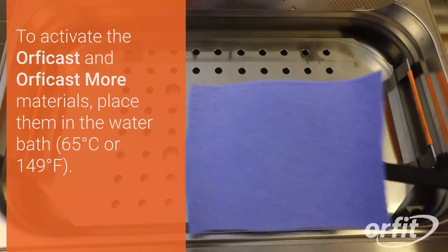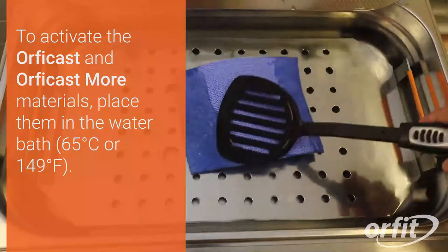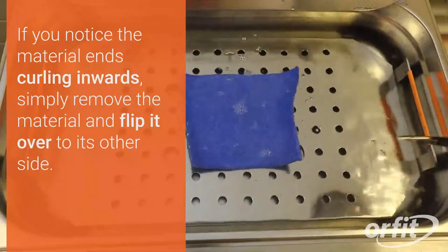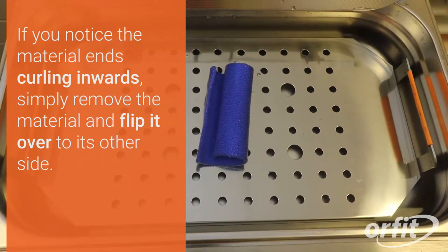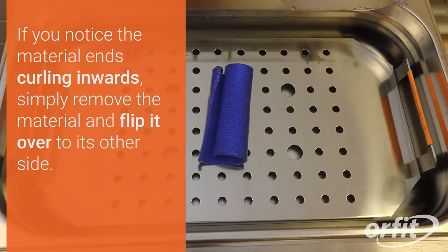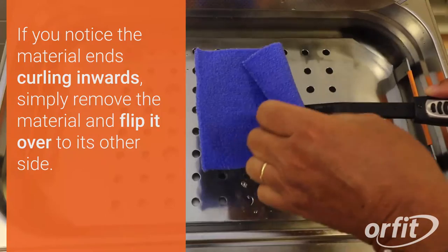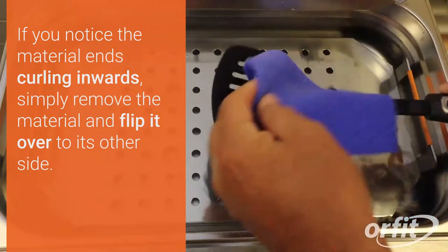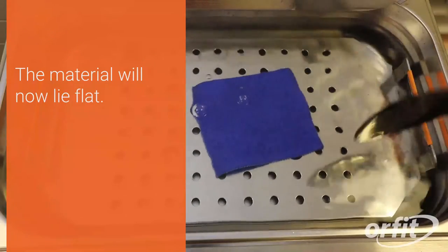To activate the Orphecast and Orphecast More materials, place in the splint pan. If you notice the material ends curling inwards, simply remove the material and flip it over to its other side. The material will now lie flat.